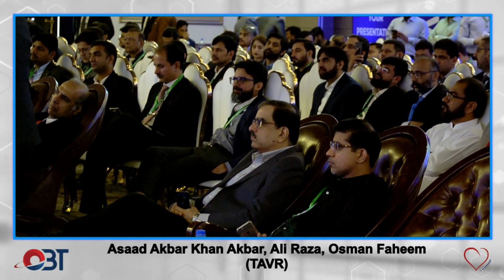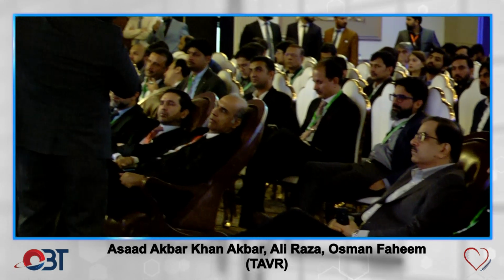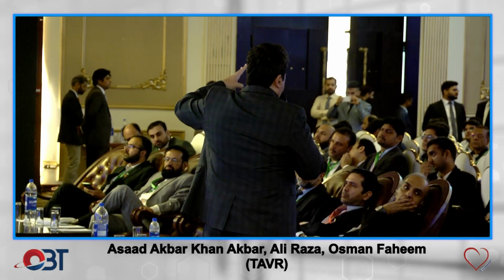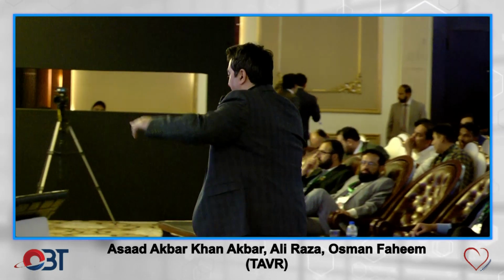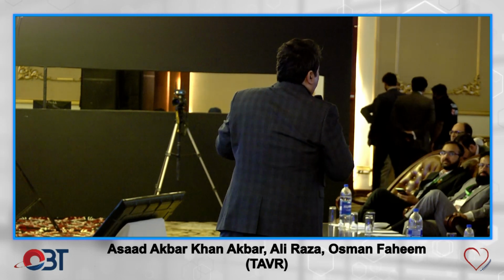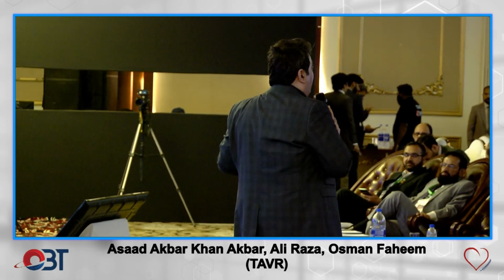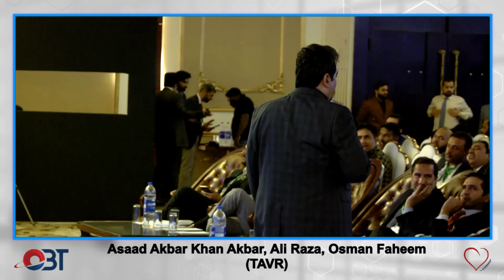So the length which I measured, the first nodal should be around 4 millimeters, and that's because the first crown is always bigger, 8 millimeters, and then the rest become all 6 millimeters. The first nodal distance is 4 millimeters. So you check it with the nodal distance, but at this time, even if you check it or don't check it, it doesn't matter because it's gone now. My checking point is at 2/3 deployment, where I can recapture it. After this, I don't even check it because it just makes me unhappy if it is too low.